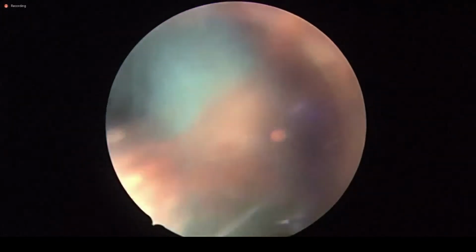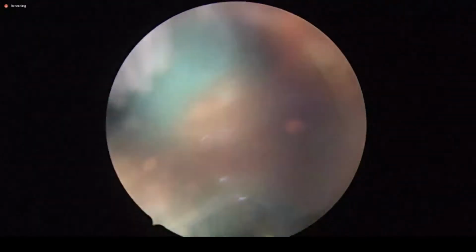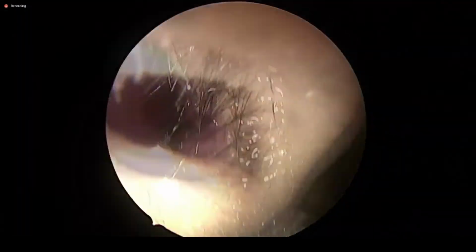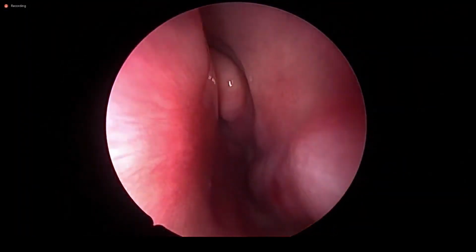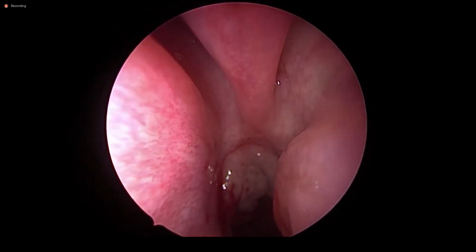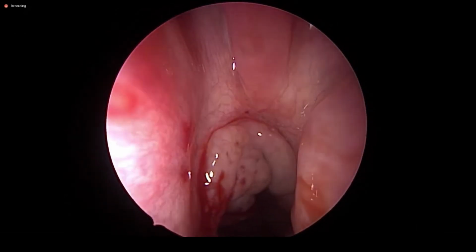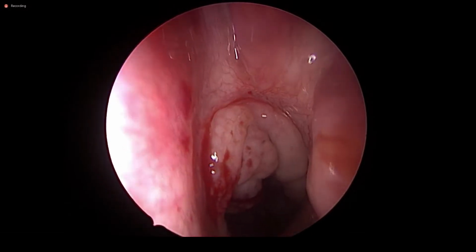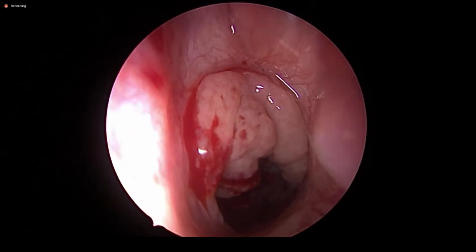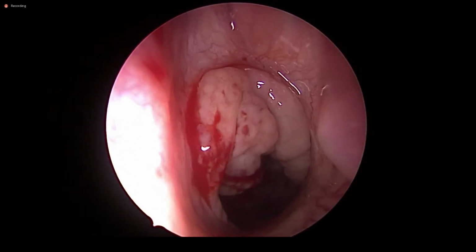Complications of nasopharyngeal cicatrization, stenosis, nasal twang, infection, torticollis, even abscess can happen when you damage the posterior muscles unnecessarily. As I told you in the beginning, the goal is removal of adenoids, not to damage anything surrounding. That's why the role of the microdebrider comes into play in the beginning, in spite of the little bit of bleeding it gives.